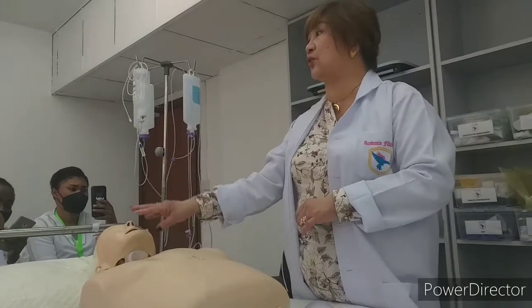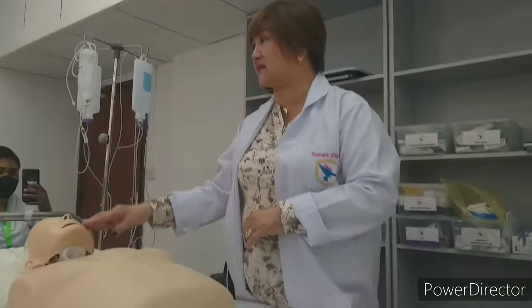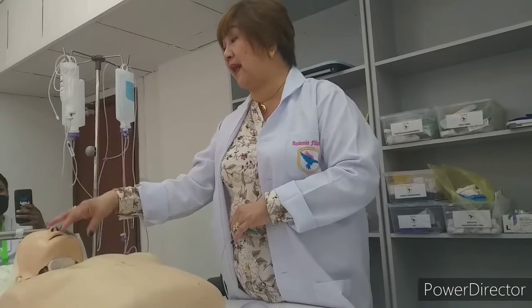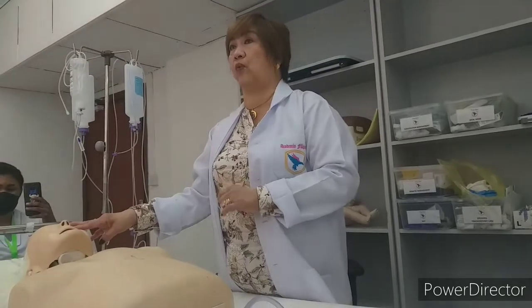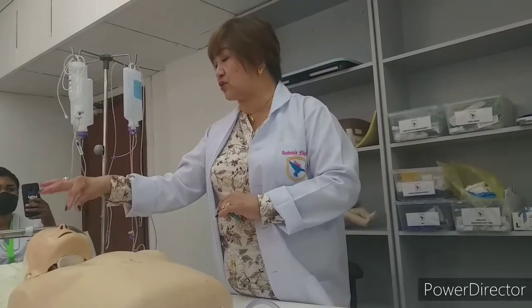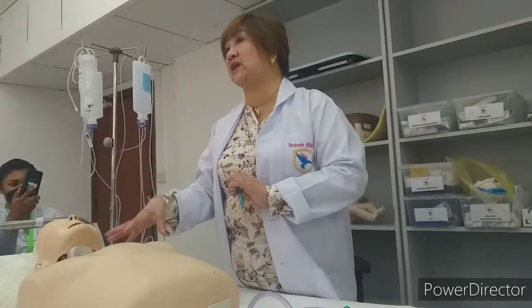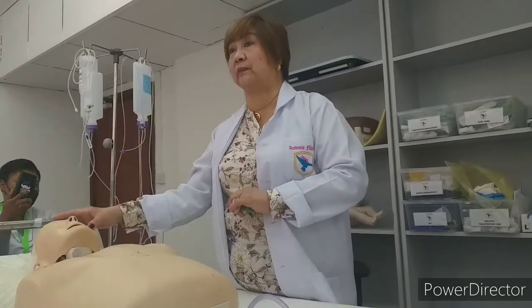We do it to give them proper breathing, because these secretions block the nose, the mouth, and the trachea. If you do not remove them, your patient is going to die. According to those patients, when they are full with secretion, they feel like they are drowning. So this is how we rescue or save our patient. We clean the nose, the mouth, and the trachea of secretion, give them good breathing, and of course keep the patient comfortable after. Although we irritate them by inserting the tube, right after that they will be comfortable.